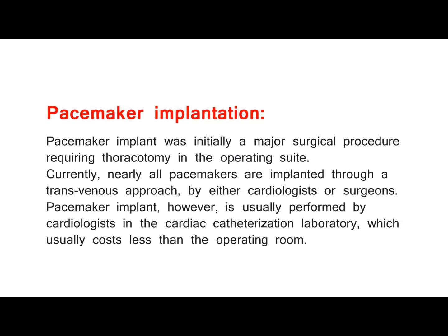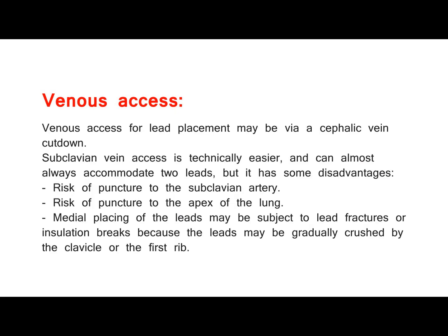Pacemaker implantation. Pacemaker implant was initially a major surgical procedure requiring thoracotomy in the operating suite. Currently, nearly all pacemakers are implanted through a transvenous approach, by either cardiologists or surgeons. Pacemaker implant, however, is usually performed by cardiologists in the cardiac catheterization laboratory, which usually costs less than the operating room. Venous access. Venous access for lead placement may be via a cephalic vein cut-down.